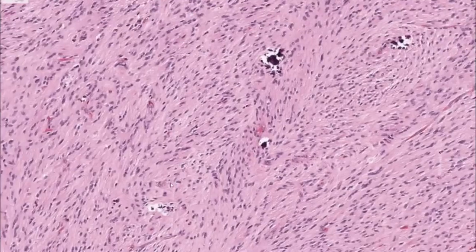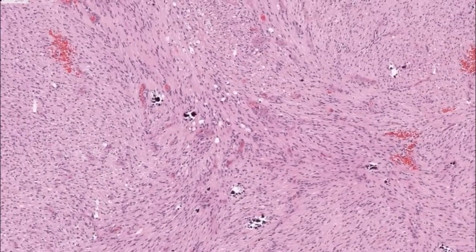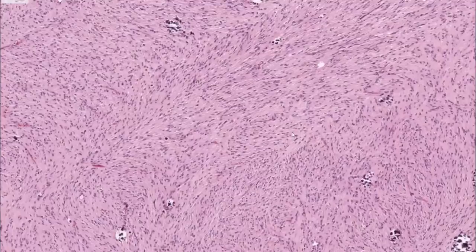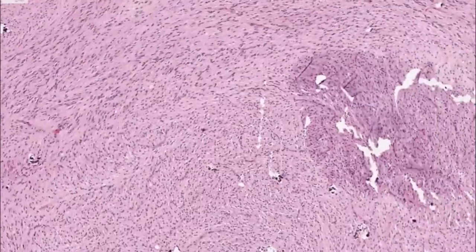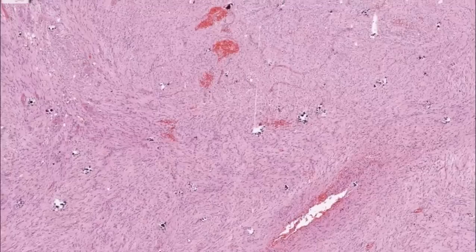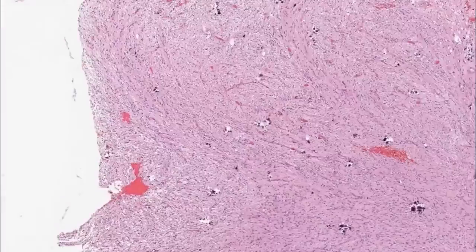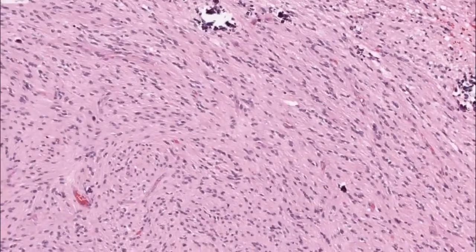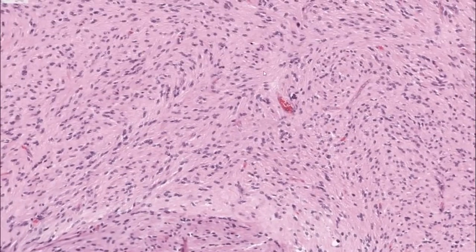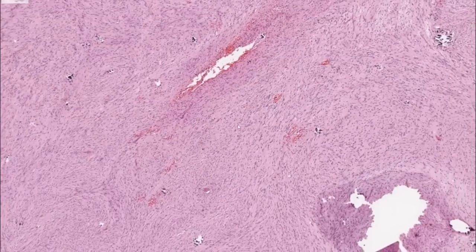The rosettes here. Now, something that is different for this tumor compared to the other ones that I've shown you is that the cells are fairly spindle. Sometimes you can even envision the formation of fascicles. Very nice spindle cell architecture. And then a suggestion of pseudorosettes here as well. Here you almost have the formation of a herringbone pattern. Not perfectly developed, but this is the main characteristic here, that you have a spindle cell neoplasm with pseudorosettes.